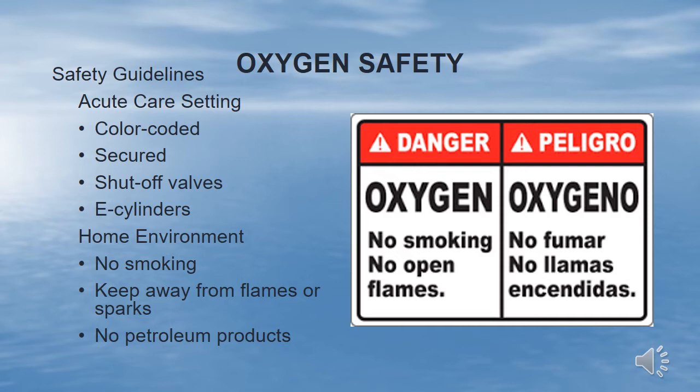In the home setting, patients and caregivers should have education about fire safety. They should prepare the environment by posting oxygen in use warning signs warning others to refrain from smoking, including e-cigarettes. Fire extinguishers and smoke detectors should be in place and in working order. Oxygen should be kept 6 feet from heat sources or potential sparks, such as open fires, heaters, stoves, and lit candles.